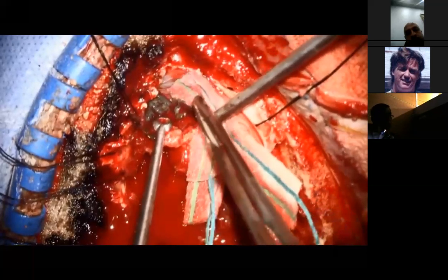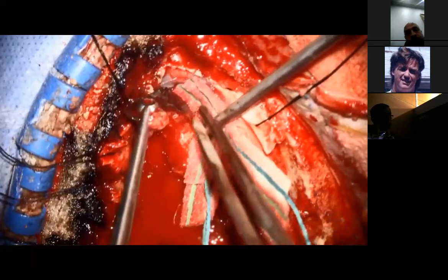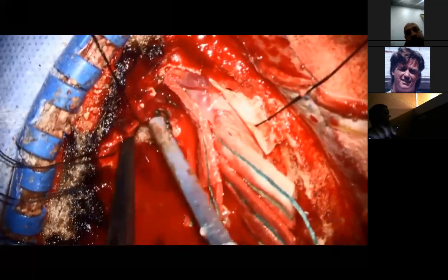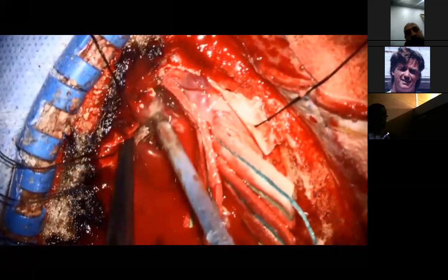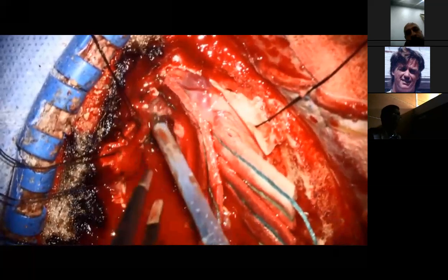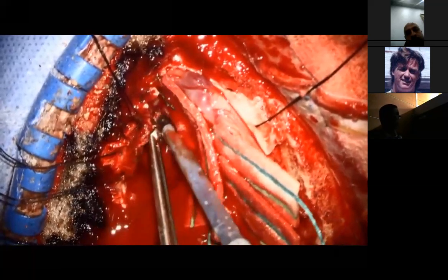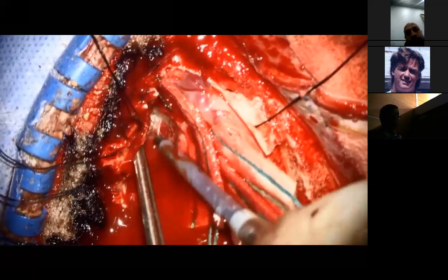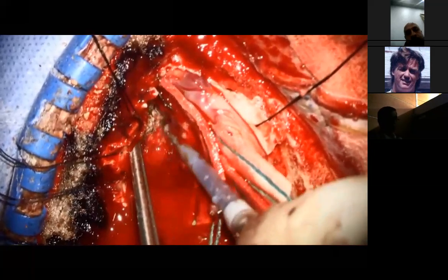Embolic material. So how did this help? It became softer. It became softer. You can see I can suck it. And it decreased the blood supply, no doubt about it. If we did not do embolization, it would have been bleeding horribly. This is continuous bleeding, but it is manageable.